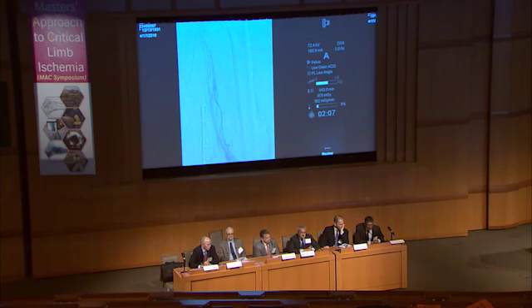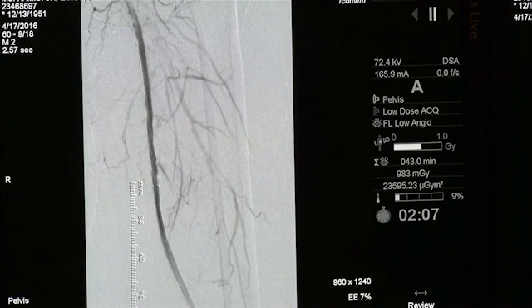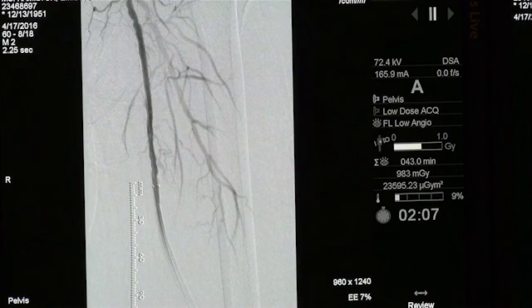That's very nice, Mehdi. Very nice work. I think we are done here. I think this proximal area looks good. That's the proximal area. We hit it with a DCB 6.0.